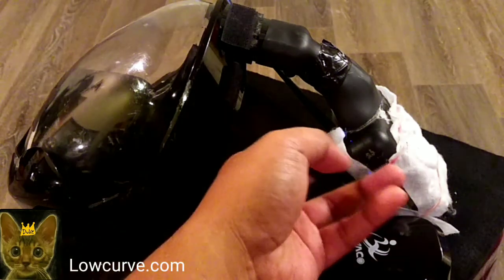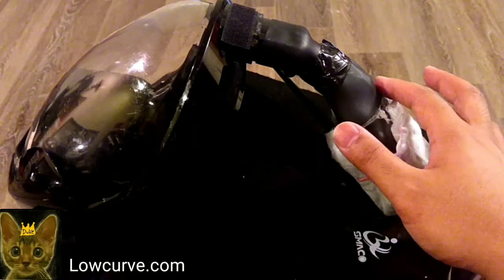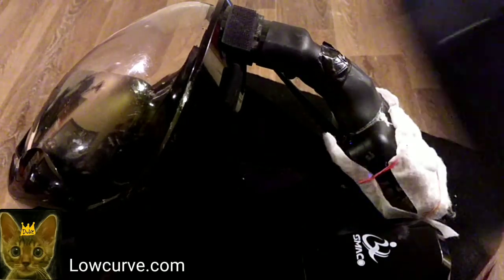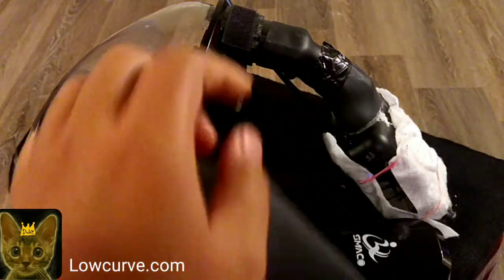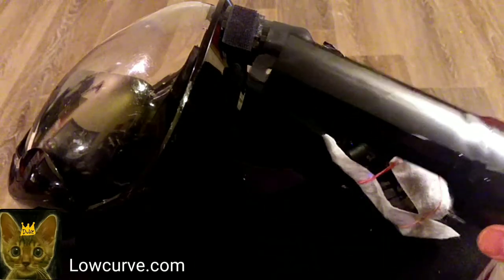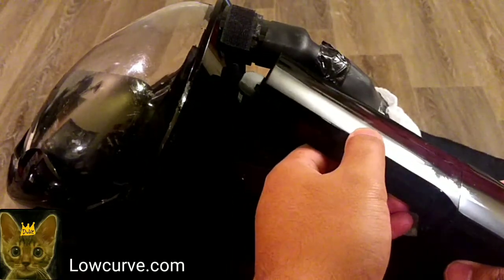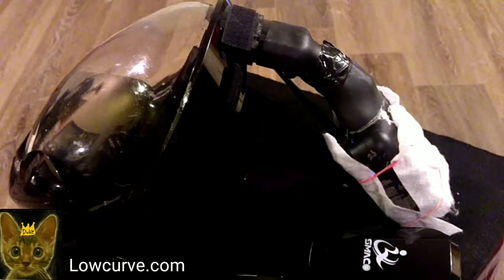So we have that clipped to the straps here. What I did was put a layer of glue down around the fan opening, and then I used some of this marine grade heat shrink material to seal that part. That's the way you would connect it to the original snorkel, making it modular so you could pull it on and off. Basically this snorkel cut off here is permanently connected to this fan, and you'd be able to pull it on and off whenever you need it. So that's the way to keep it modular if you only have one mask.